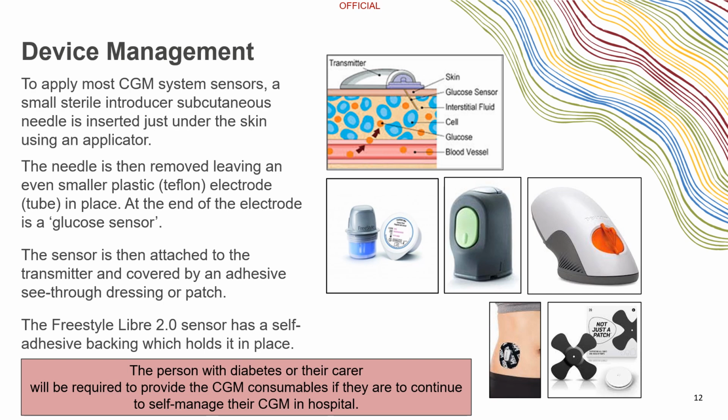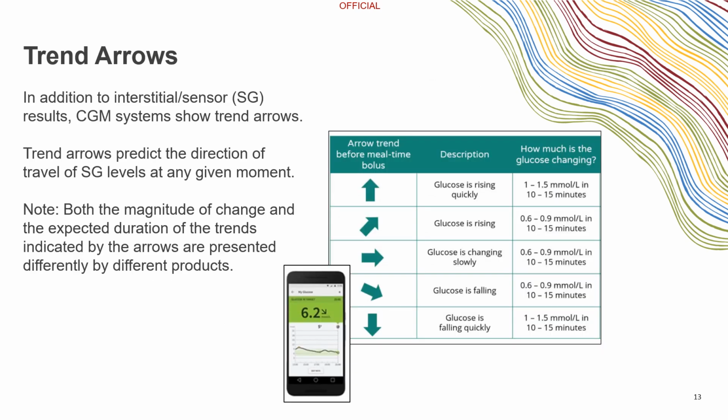For people with diabetes who are keen to continue to use their CGM during the course of an admission, they, or their parent or carers, will need to provide the CGM consumables to do so.